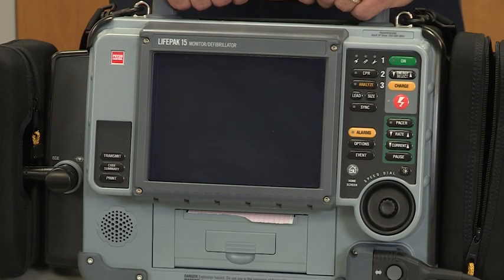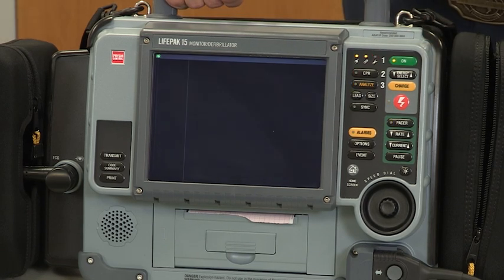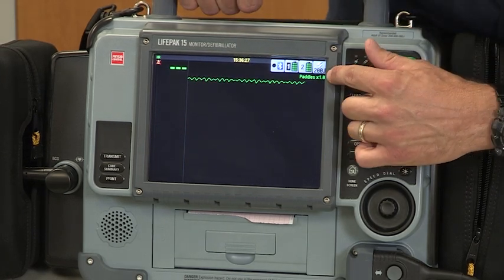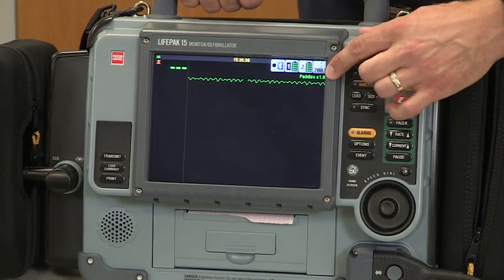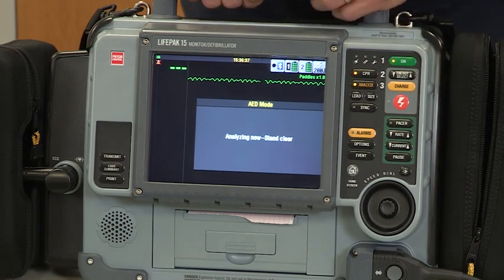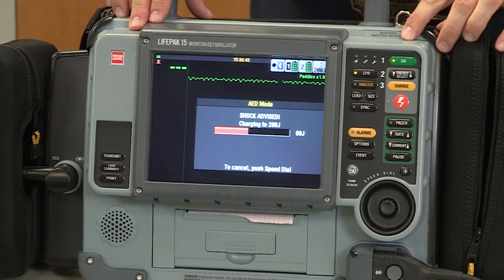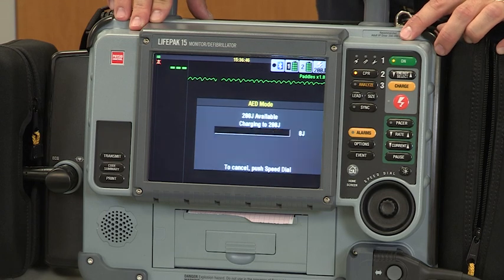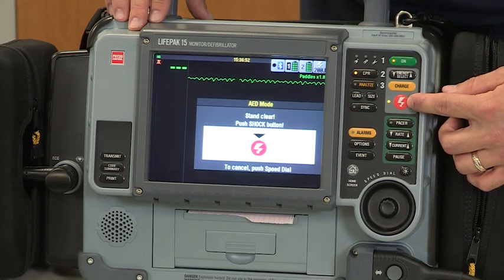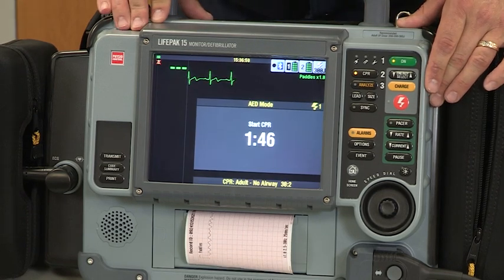Now we'll go into the A.E.D operation. Simply turn the machine on and connect the patches per the diagram. Again, as review, it comes up automatically in the paddles mode for manual mode. Come over to the Analyze button and press it. Analyzing now. Stand clear. Shock advised. Stand clear. Push shock button. Once the patient is clear, press the shock button and continue with your CPR protocol. Start CPR.